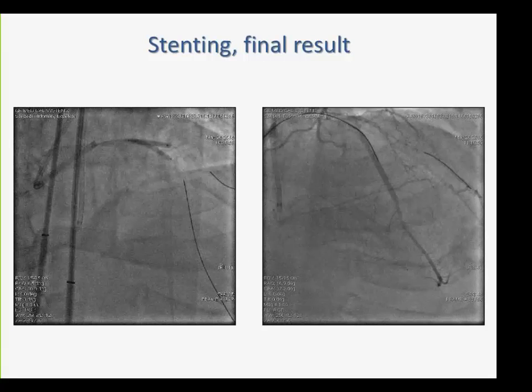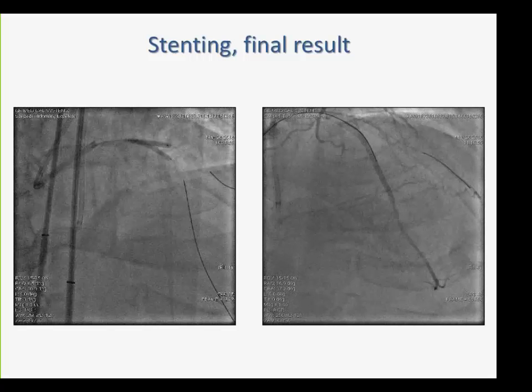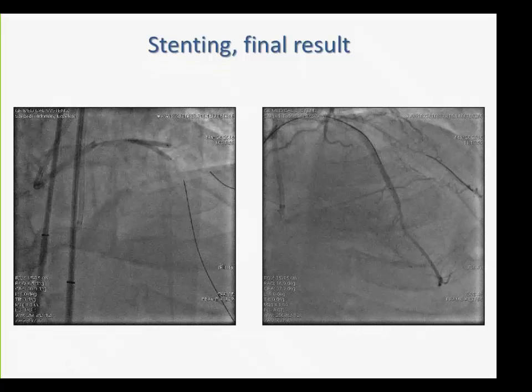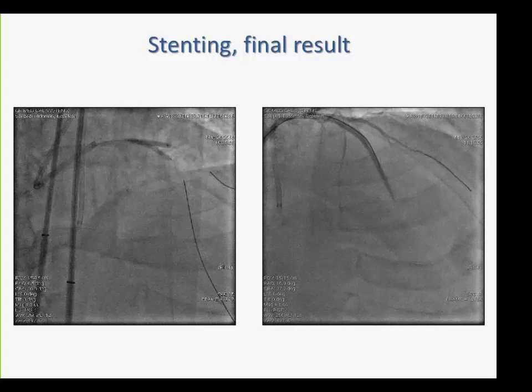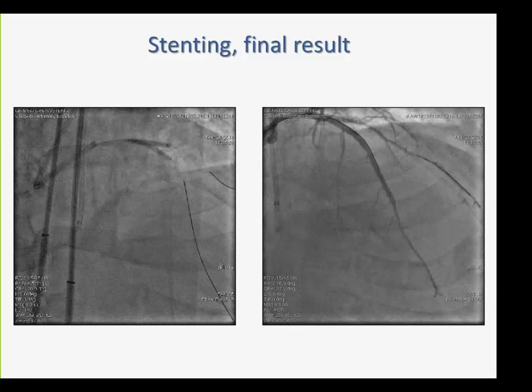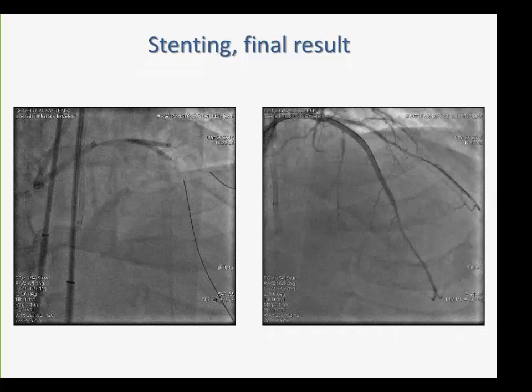And plan B for stenting for us was indeed crush stenting. But after this low-pressure predilation of the bifurcation, we realized that there is no contrast staining and there is TIMI 3 flow. We decided to use the provisional T, which statistically promises a better long-term result.